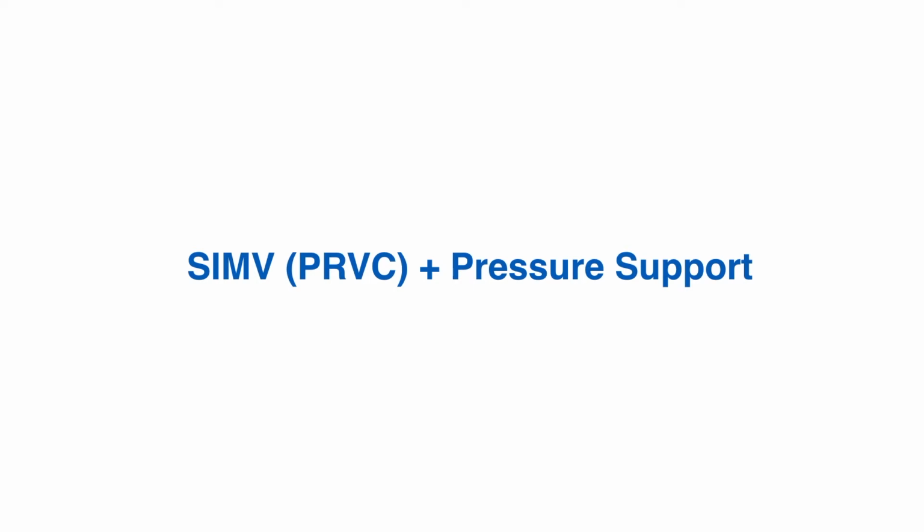So starting with pressure control, at the start, like I said, you set the ventilator up just like we've described. You pick your inspiratory time that you want the breath to be delivered over, and then what you need to do is select what peak pressure you want to be delivered for the duration of that inspiratory time. The thing with this is the volume that is delivered will vary depending on how compliant the lungs are. If you've got very compliant lungs, you'll get a big tidal volume, whereas if the lungs aren't so compliant, setting the same pressure will mean there's less of a tidal volume and less ventilation.